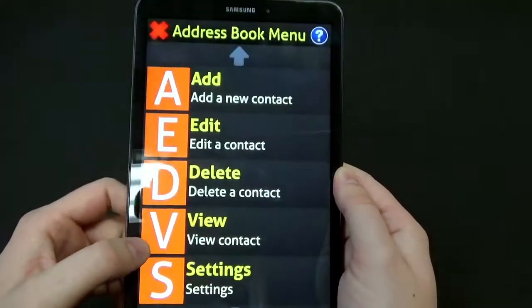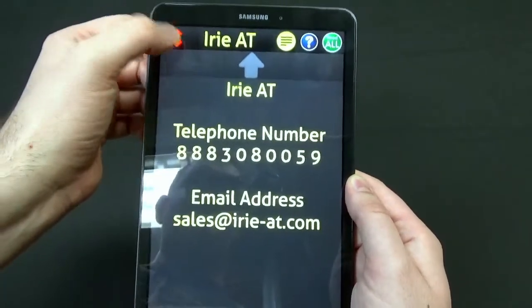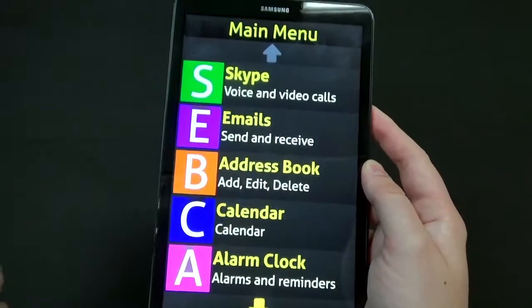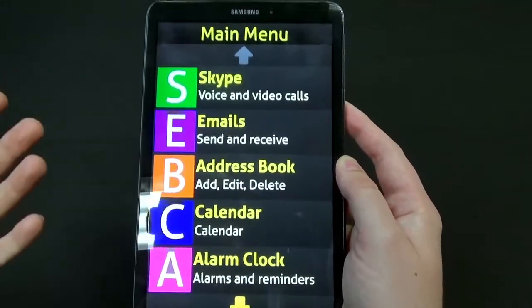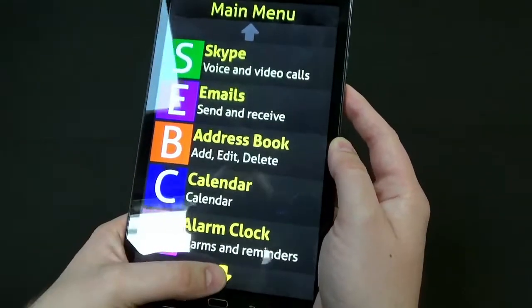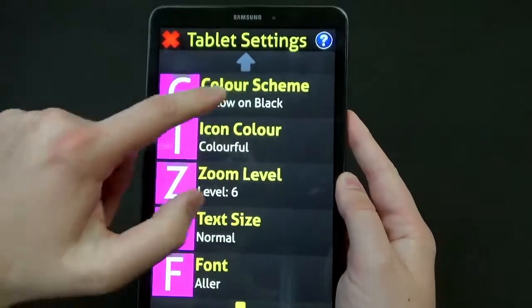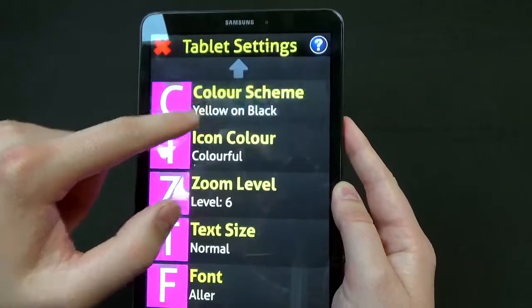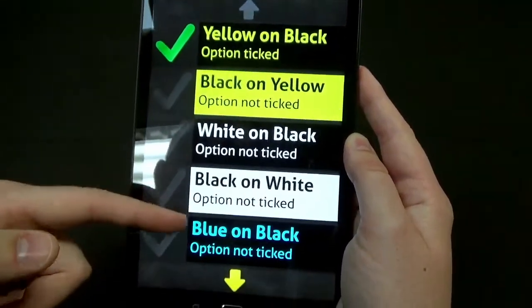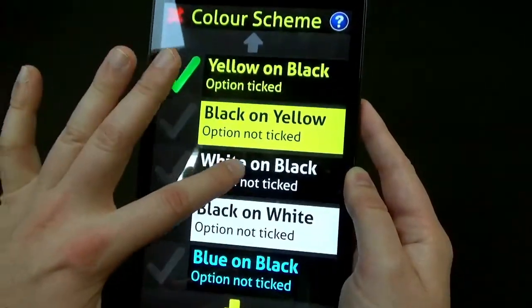Let's take a quick look at the address book to see what it looks like to view a contact. You'll notice it talks all the time — you can turn that off if you'd like, so you can use it with speech or without speech. You can also customize the interface. Going to settings, we can change our color scheme. Right now it's yellow on black, but we could do black on yellow, white on black, black on white — there's a whole bunch of different color scheme options to fit whatever's best for you.